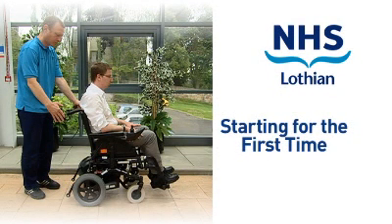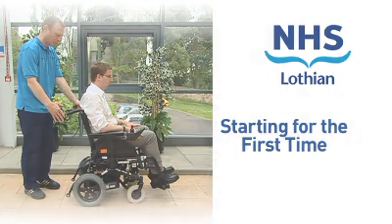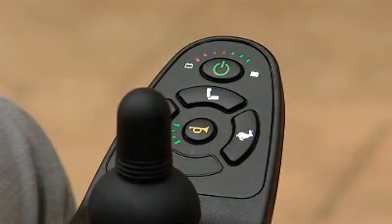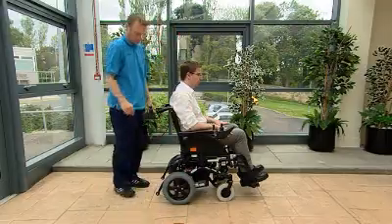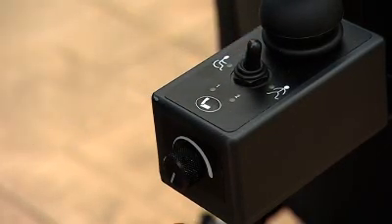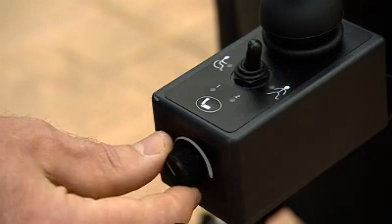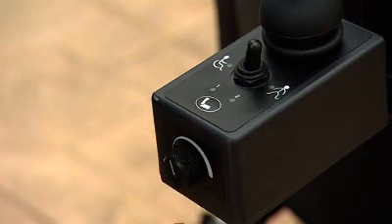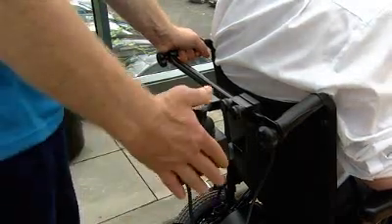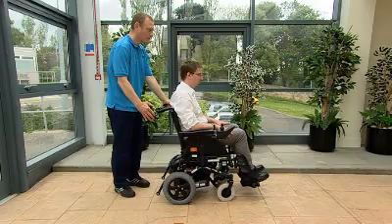Starting for the first time. Switch the wheelchair on. Check that the control toggle switch is set to attendant. Adjust the control speed to slow so the dial is at 1/4 of the maximum setting. Continue to grip the push handle and place your other hand on the attendant control joystick.